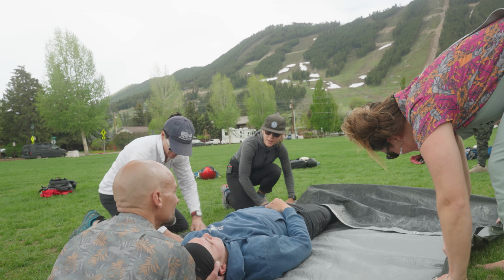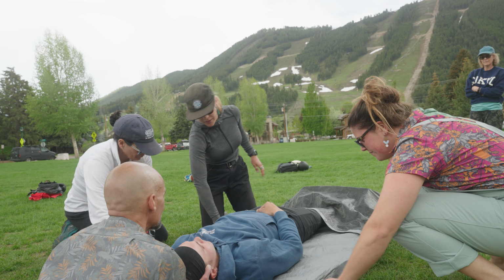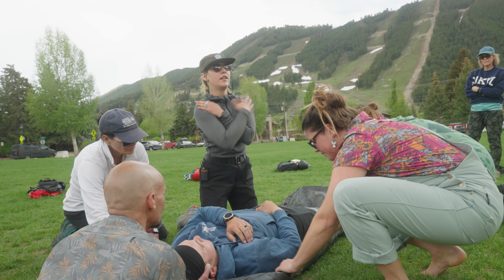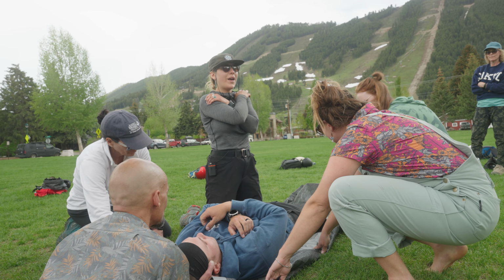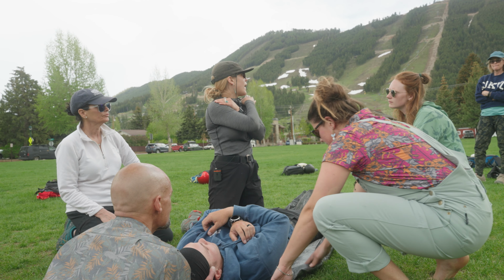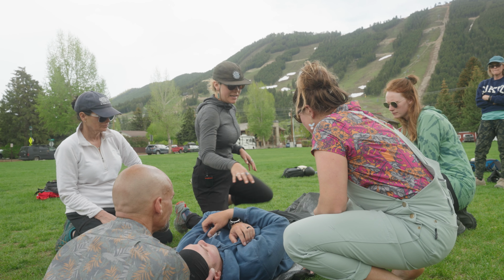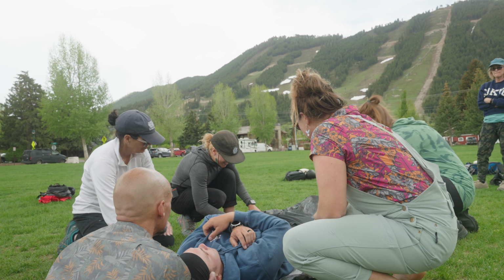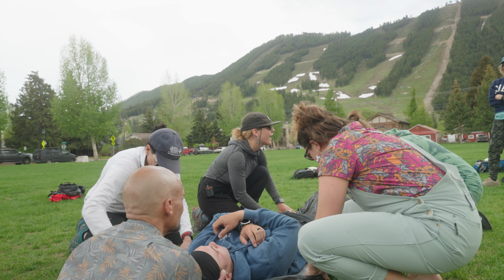Now we're going to roll this in towards the patient. What we can do here is have the patients kind of be mummy style, cross the arms so they're not getting in the way. If the patient doesn't have muscle tone, we can do a light bind just to keep those out of the way while we're moving the patient. Now we want this roll to be as tight as possible and as close into the person. Why?